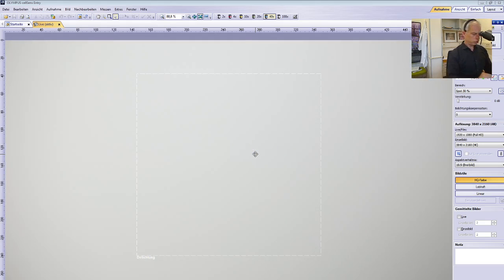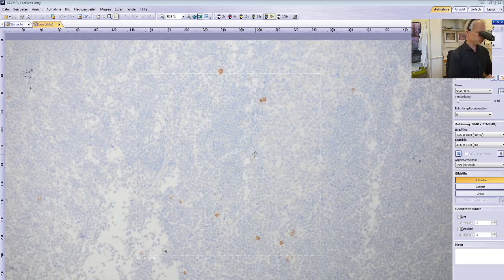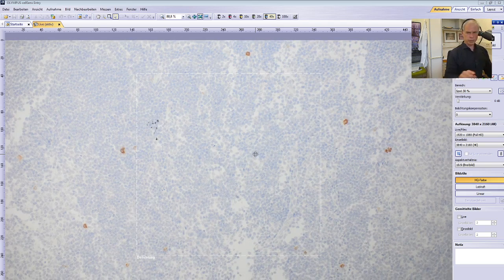Important for me is also to check for myeloperoxidase as a third lineage, the myelopoietic differentiation, and I don't see any expression. These are just normal small granulocytes being positive in the infiltration. So these are precursors.